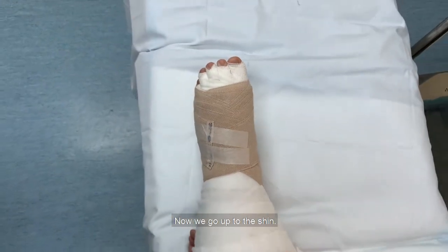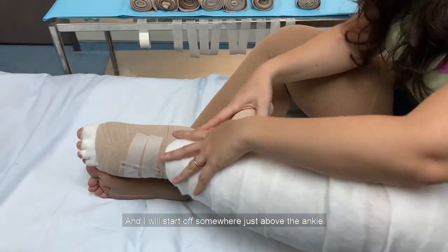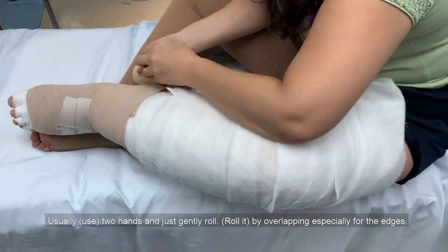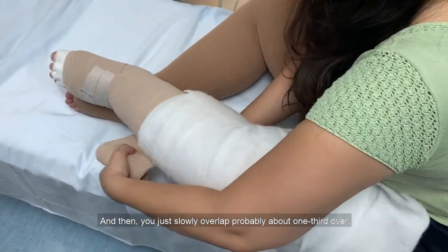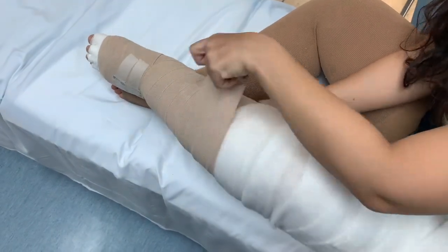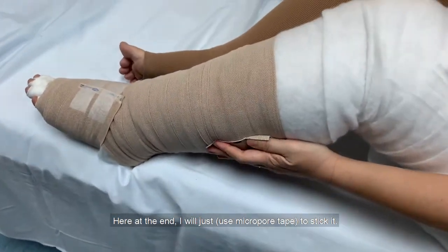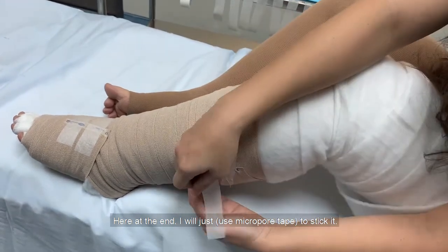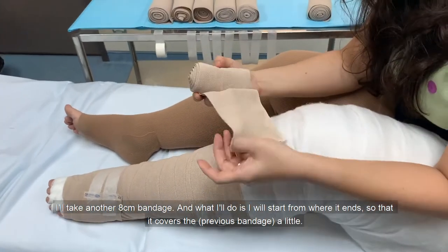Now we'll go up to the shin. For the shin, I'll use a 10cm bandage. Start off somewhere just above the ankle and begin rolling again, usually with two hands, just gently rolling with a little bit of overlapping especially at the edges, overlapping about one third of the way. Continue up to the end of the shin, then secure it with a strip of tape. Then take another 8cm bandage and start from where the previous one ended to cover that area.